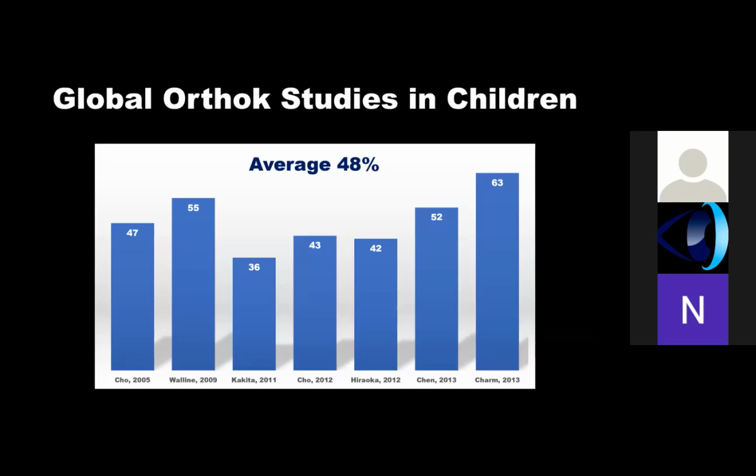Yeah, Randy, sure. So basically what we're talking about is we're looking at the average progression of the study group versus the control group, right? And so when you look at an average, you then have to look at either the standard error or the standard deviation to know exactly what's happening. And I think it's pretty safe to say that in these studies, you get variable treatment effects. Is it every single patient grows half as much as their control matches? No, absolutely not. We have some individuals who don't progress any differently than those who are in the control group.